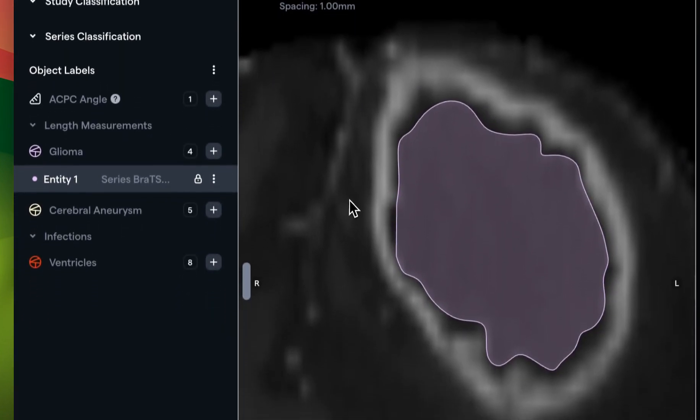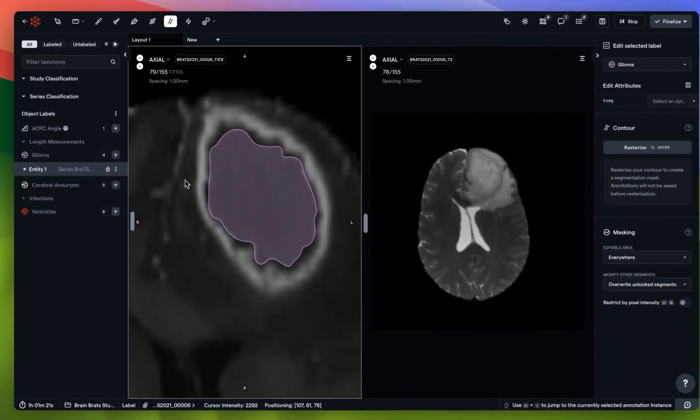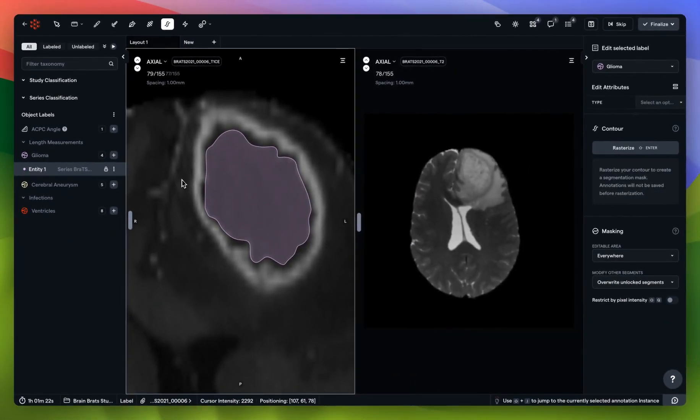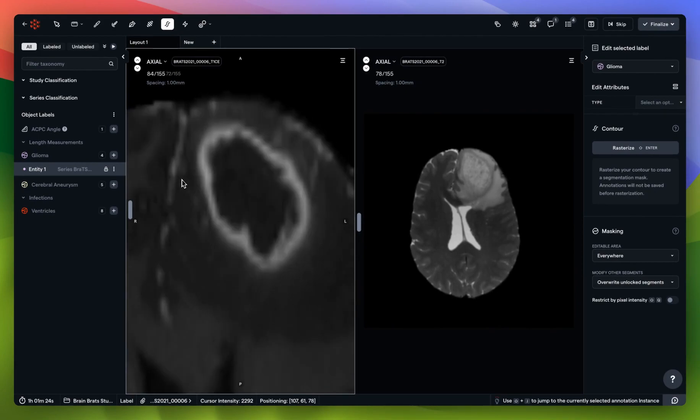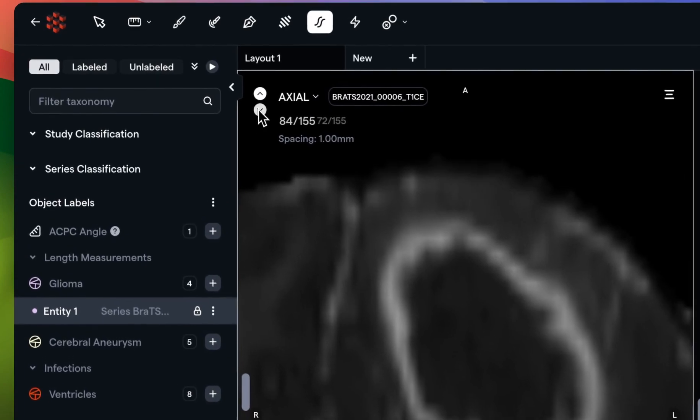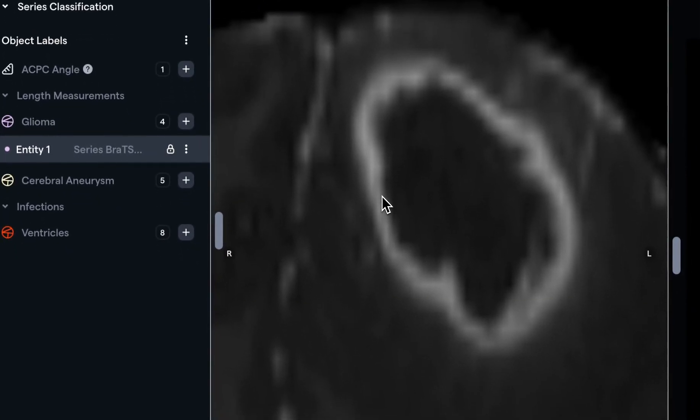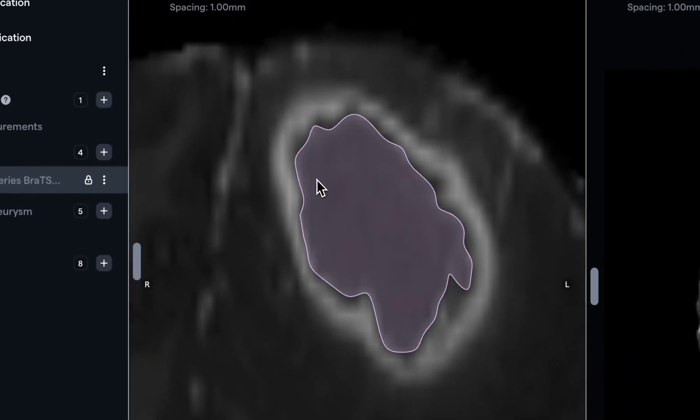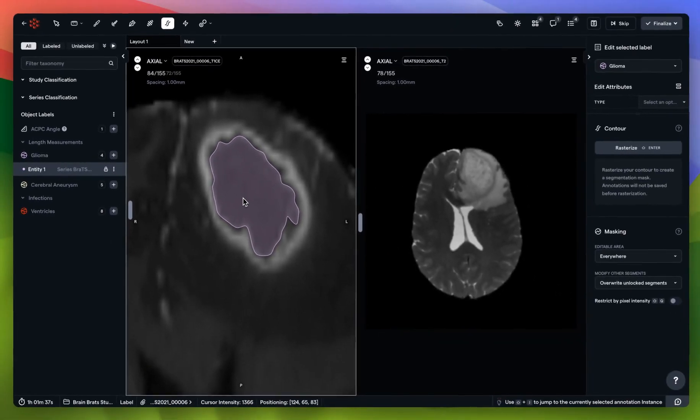However, the contour tool has interpolation. What I'm going to do instead is go up one, two, three, four, five slices by using the arrow keys on the keyboard. I'll do the exact same thing. I now have a contour on slice 84 and I have a contour on slice 79.